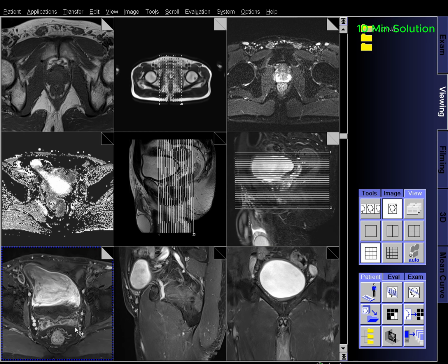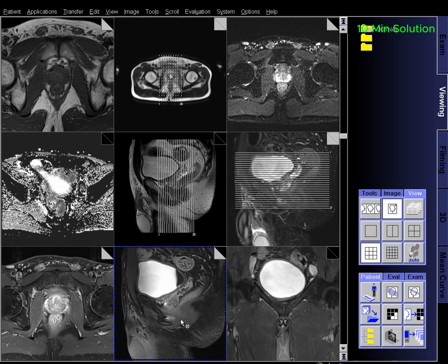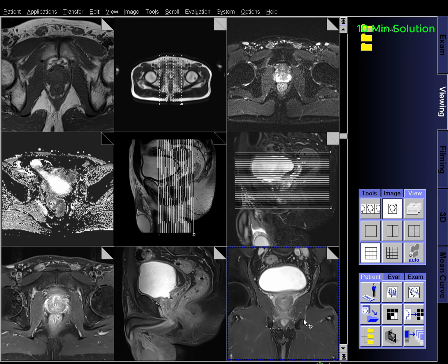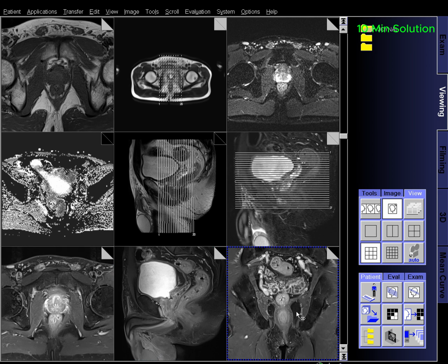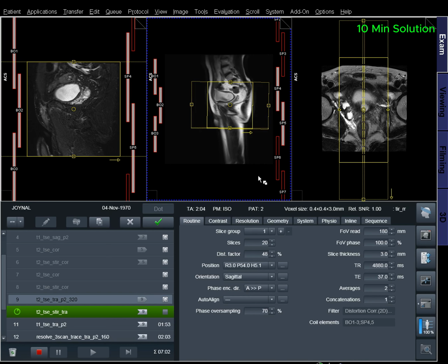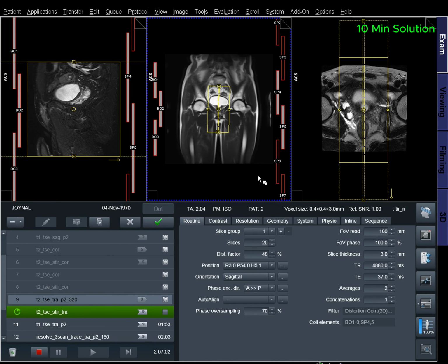Many people don't know that the prostate gland is a very important organ in men, located just below the urinary bladder. Diseases related to this gland, such as prostate inflammation, prostate enlargement, or prostate cancer, are often diagnosed through MRI scans, which play a vital role in detection. Now, let's find out how a prostate MRI is actually done and what it reveals.